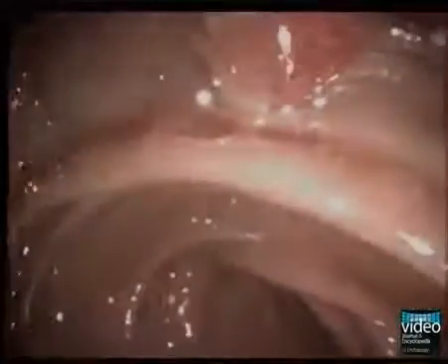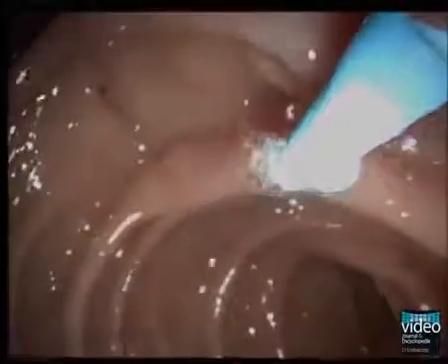The key to successful cannulation is optimal positioning. The endoscope should be in the short and straight position, and the axis of the catheter needs to be aligned with the axis of the bile duct or pancreatic duct.